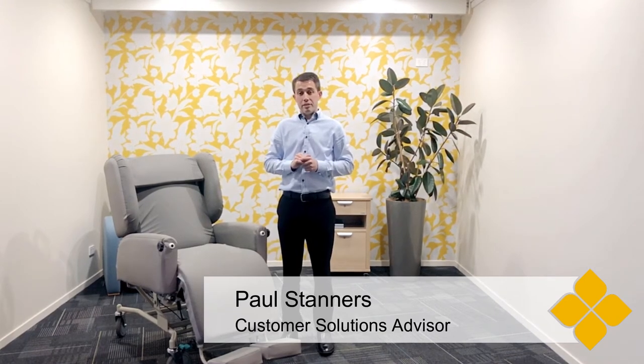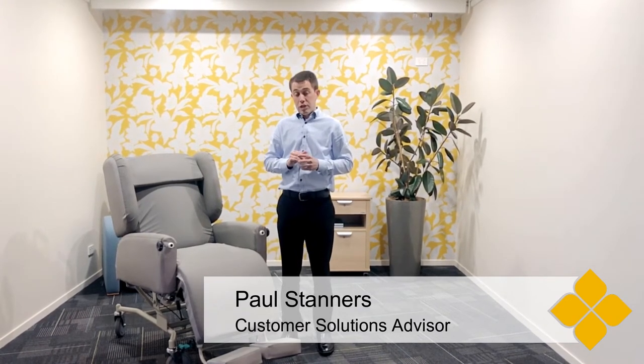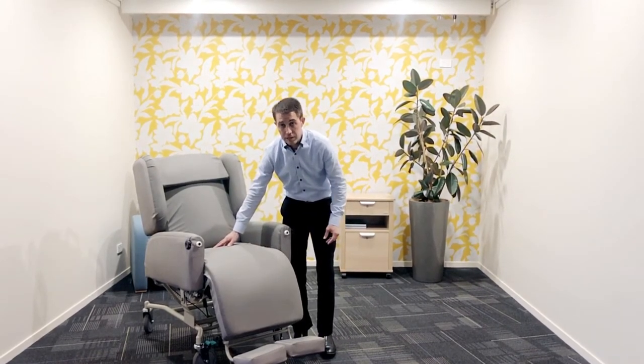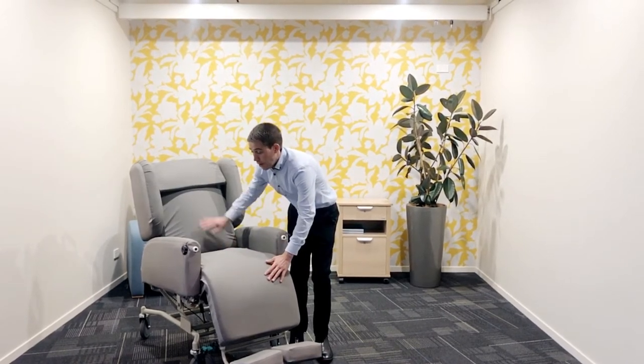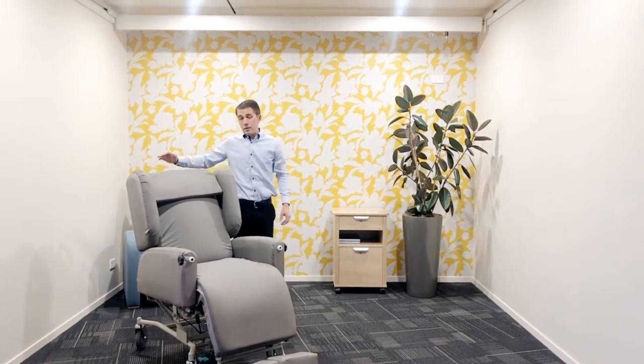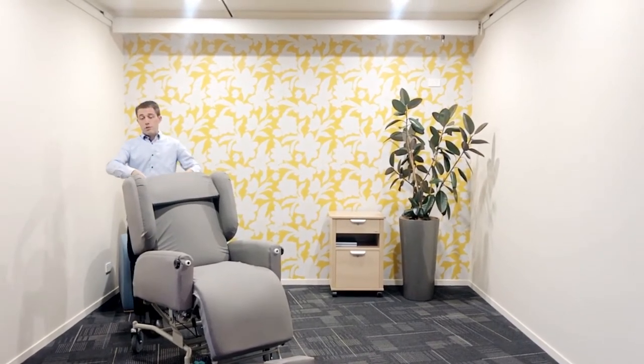Hello, today I'd like to show you the X6 Care Chair. This chair bed provides excellent support for high pressure needs residents or clients. One benefit of this chair is the air pillow in the seat, so there are no extra pillows required. That, along with the supportive foam and no joins, and the adjustability of the chair, means this is very good for high pressure needs.